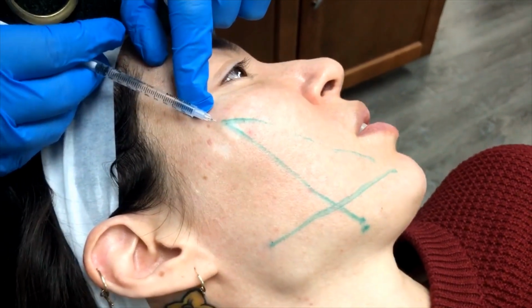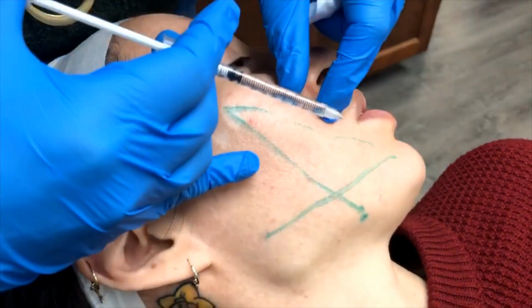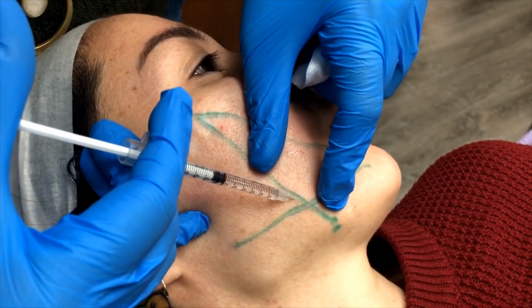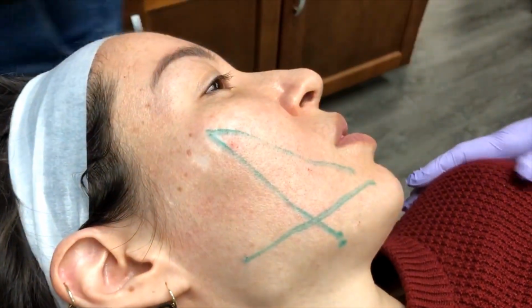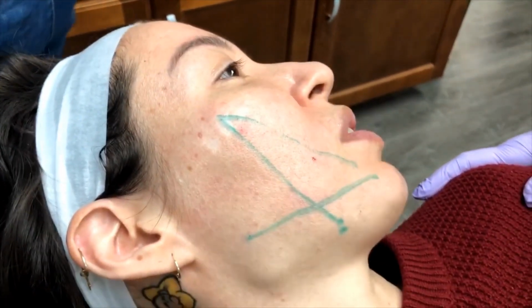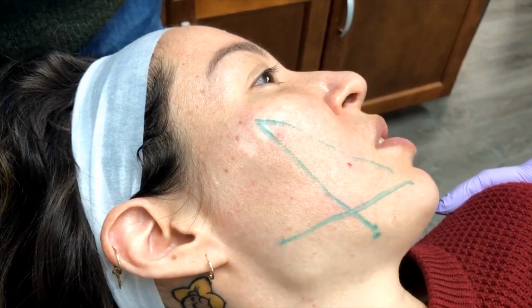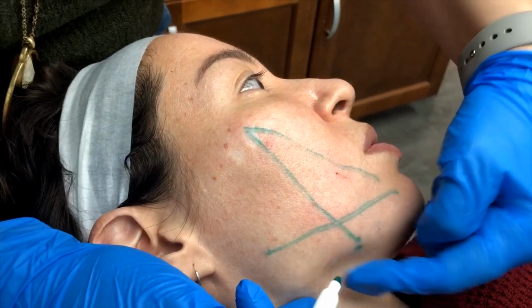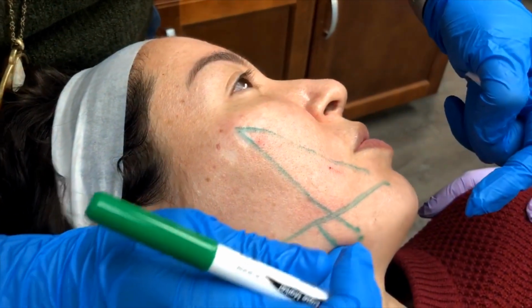I want to show you a great case of solid filler lifting PDO threads. Take a look how her jawline is not straight. Everything is starting to sag as she gets older. So let's go ahead. We've got her mapped out, cleaned up really well, mapped out using ComfortTox syringes loaded with lidocaine 2%. That's going to keep her nice and numb at the actual point where we start and towards the end of that thread. We just like to go for the ultimate in comfort here and let that take effect just a little bit. We are now marking where the area is, her facial artery.